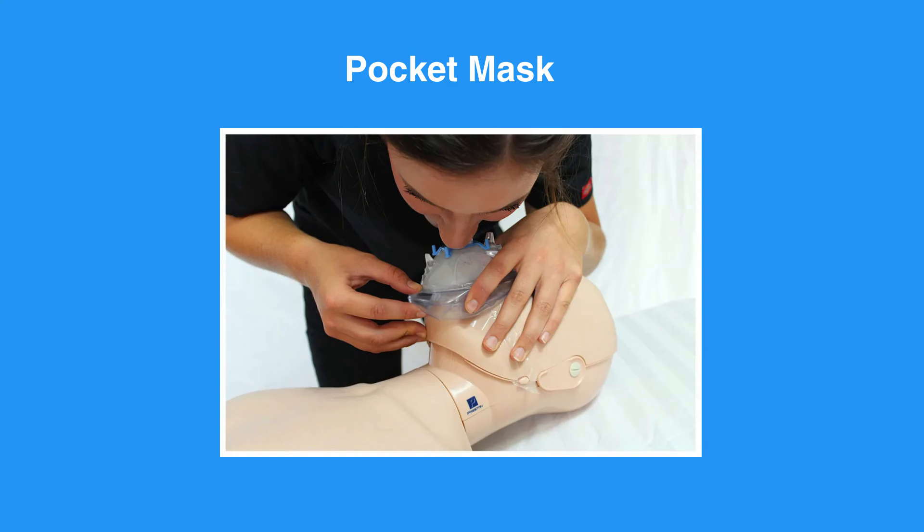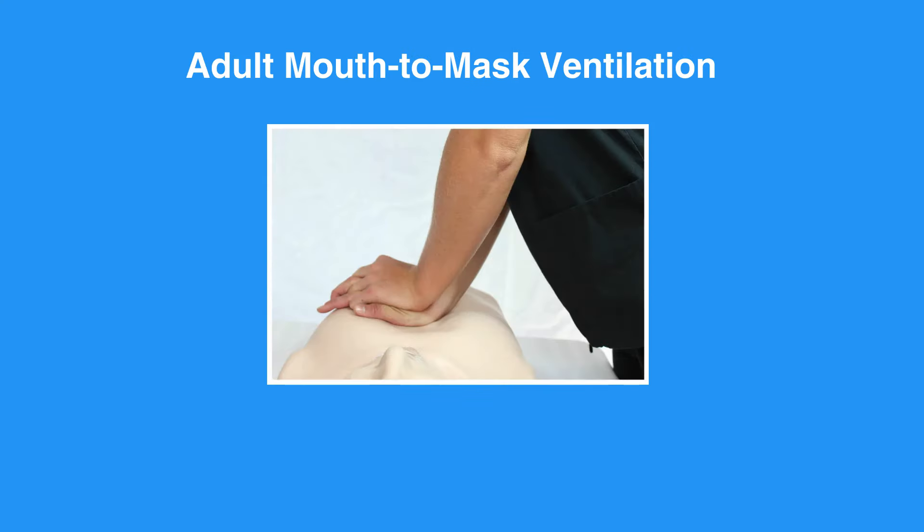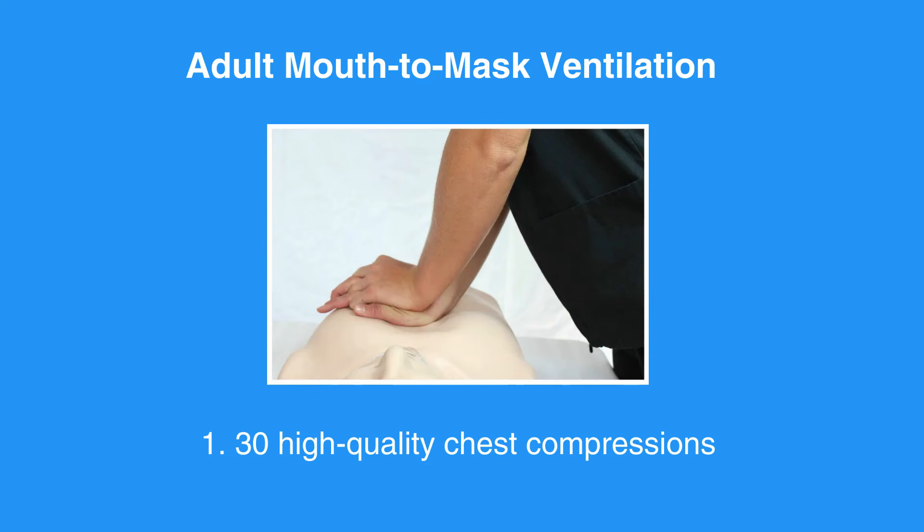Breaths should be supplied using a pocket mask if it's available. First, give 30 high-quality chest compressions.